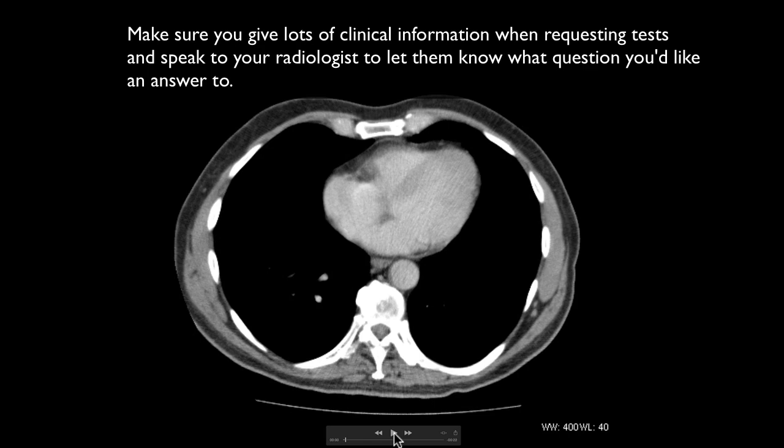Sometimes you don't need intravenous contrast. For example, if you're looking for renal stones, having the bright renal stone on the background of an unenhanced kidney is very easy to see. Whereas with contrast, it can paradoxically make it more difficult to make the right diagnosis. So it is absolutely critical. You're not just being grumpy, it actually makes a difference to what you do and the result you get in treating the patient. So some of the time we're not being grumpy. Yeah, that's right. That's only some of the time.